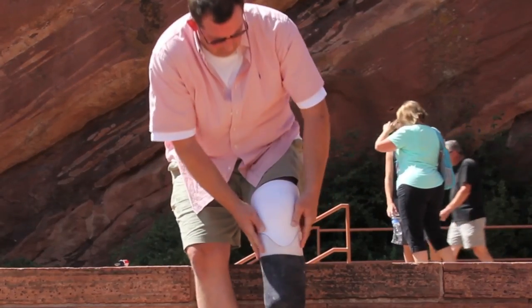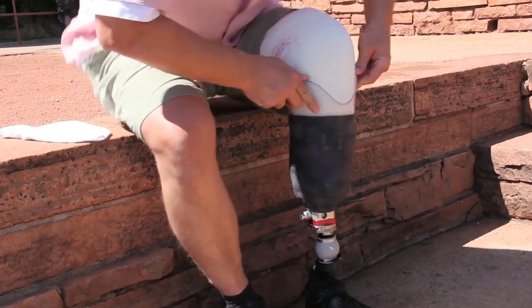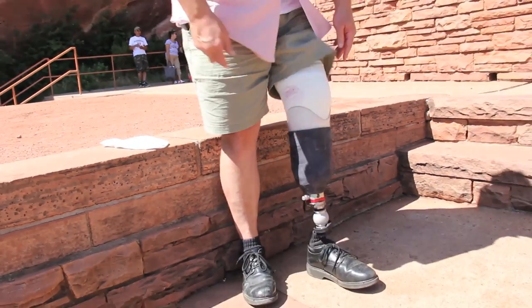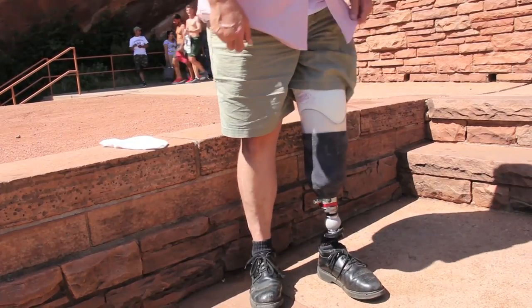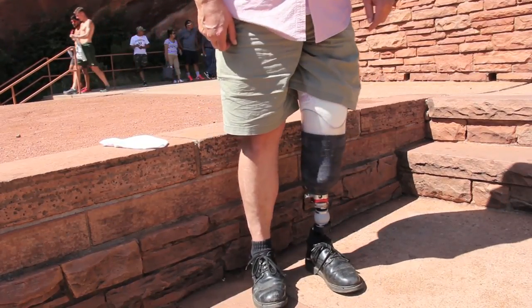Push the residual limb into the prosthetic socket. The pin will insert into the lock and click down as the limb goes into the socket. It should take some effort to put on the prosthesis. If it clicks down easily, a thicker prosthetic sock may be needed.